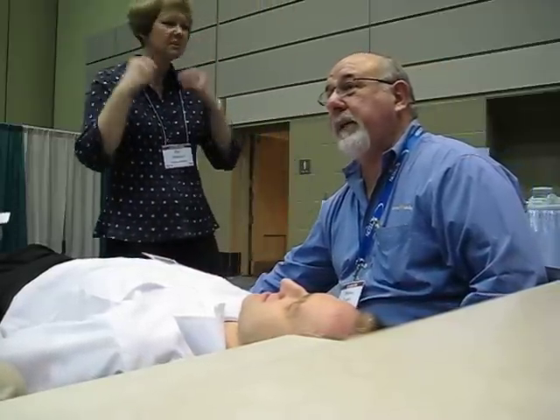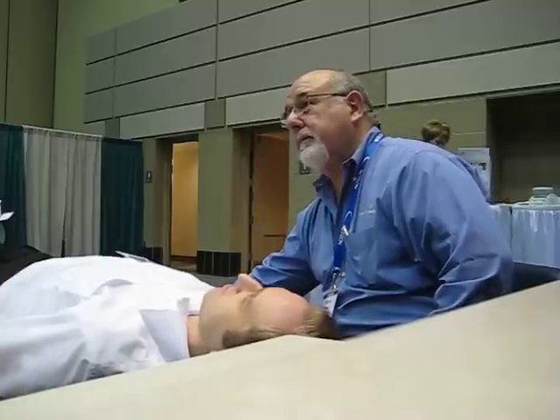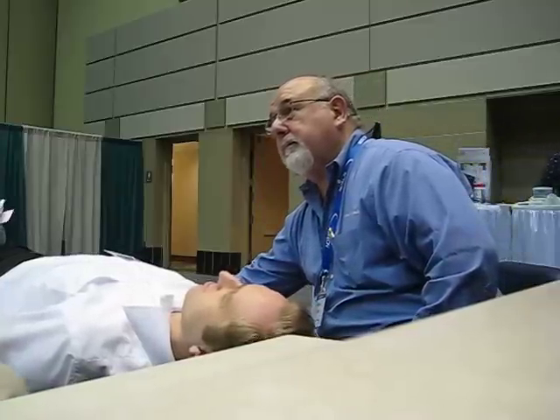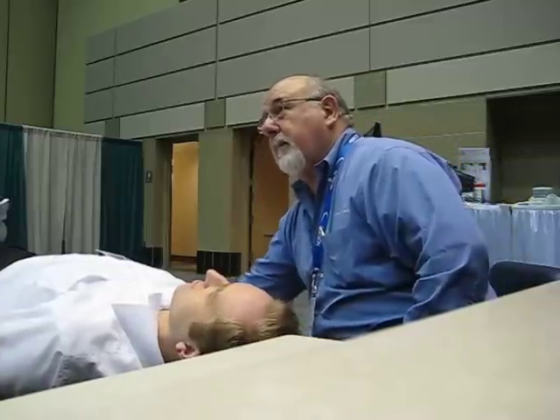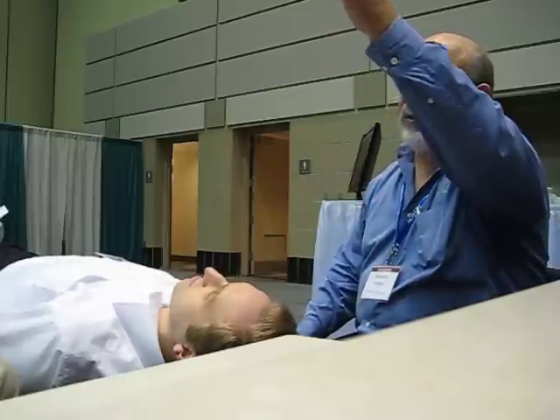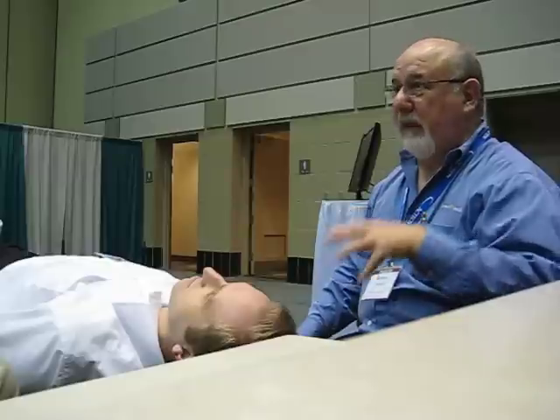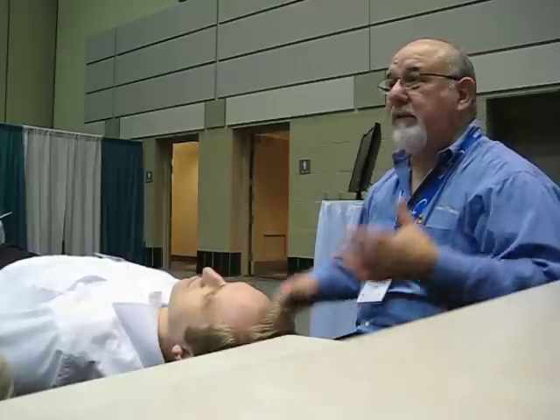This is the only chair made that does that. Well, I understand the value of a traversing chair if you've got a room that's not 11 feet long. But now do you understand the value of it from total ergonomics, that the oral cavity is always in the same plane? That is why doctors that have traversing chairs always want another traversing chair, because they've gotten used to that.